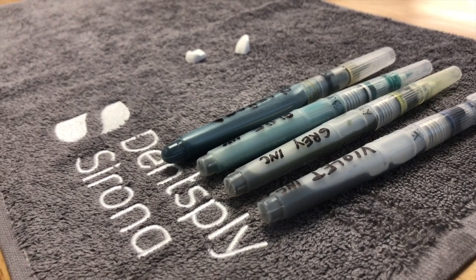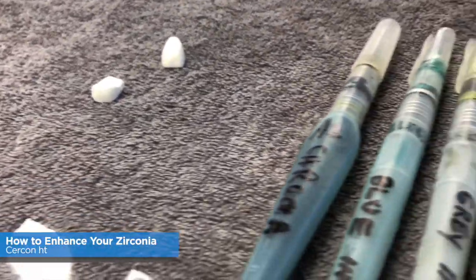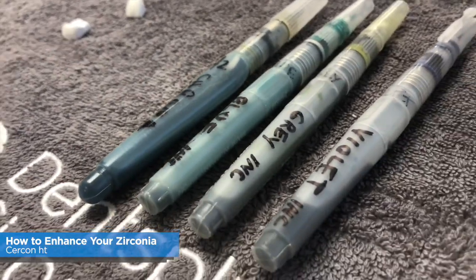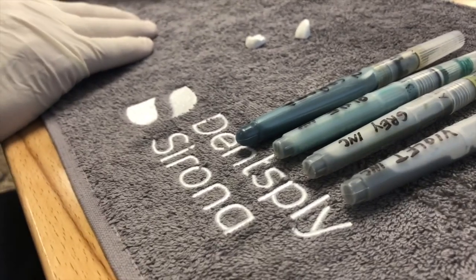Hi, this is Bill Atkison from Bella Vita Dental Designs and today's Tech in Two, I'm going to show you how to enhance your zirconia. We're going to start with whether you dip or whether you get a pre-shaded zirconia — we have pre-shaded here, Cercon ht.